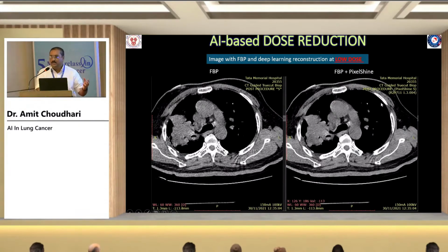CNN-based upsampling techniques or noise reduction algorithms, we can see that we have a CT image which has far better delineation, has sharper margins, and lower noise in this image. Again, you can also appreciate that these streak artifacts emanating from the bone on the left side are significantly reduced using CNN-based dose reduction technique.